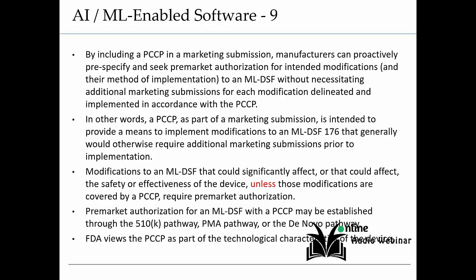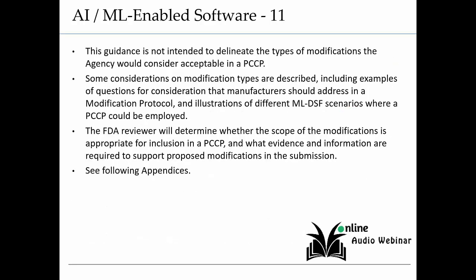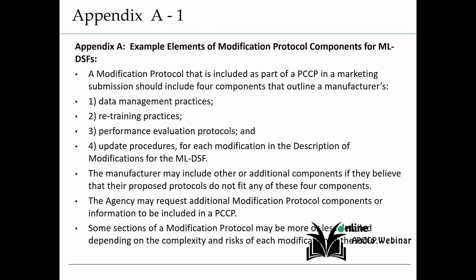You're expected to be submitting that into a marketing submission, which is either a 510K or a PMA. Substantial equivalence, so a predicate device. The guidance is general. It doesn't intend to get into the details of a PCCP program. It's up to you to make that determination. And then there's an appendix of some of the considerations to be addressed under a PCCP.